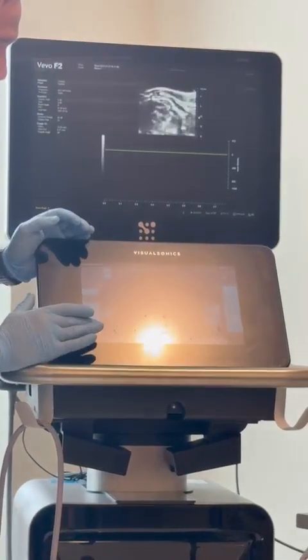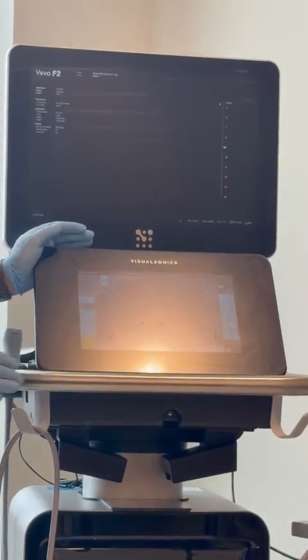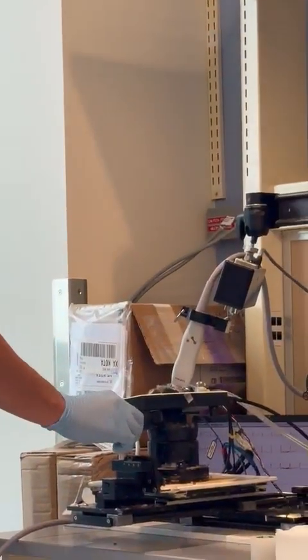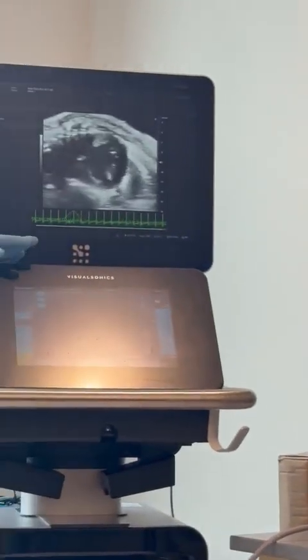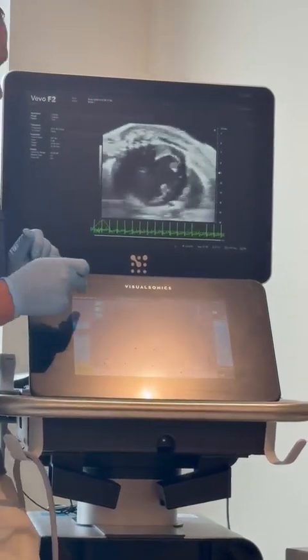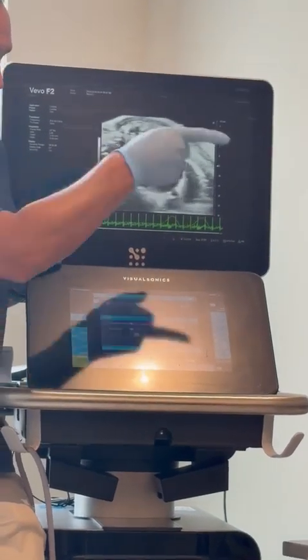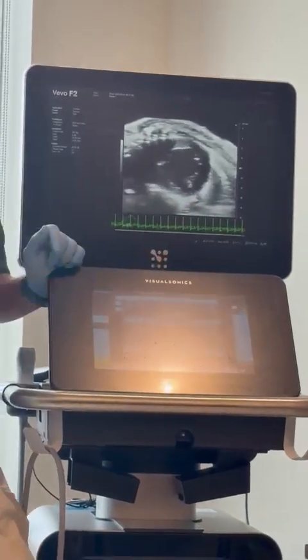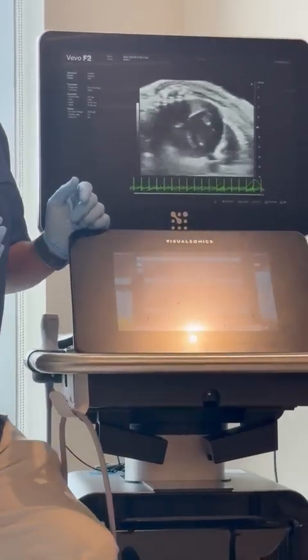All right. We're going to go back to our B mode, come back to our short axis image here, and now we're going to do a 4D scan. So we're going to click on this box. I had talked about the stop position. I want to set my stop position first. That way when I set my start position, it's ready to start its scan.